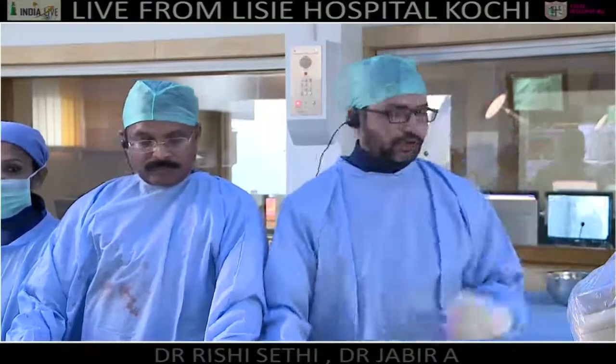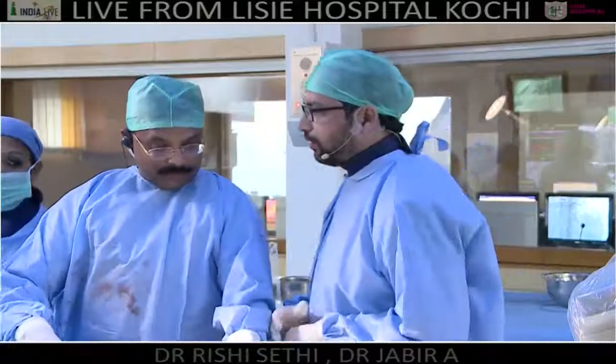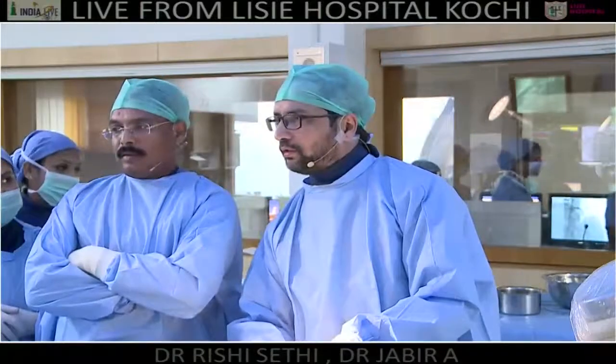Yeah, we can shift to the other lab. So we'll go ahead with the FFR of this. We'll do an IVUS first and then we can go for an FFR. Right.